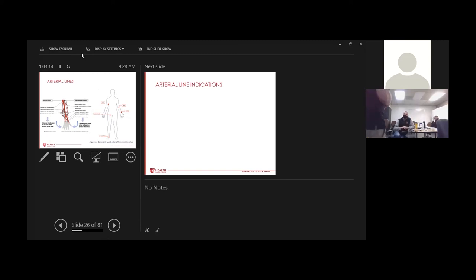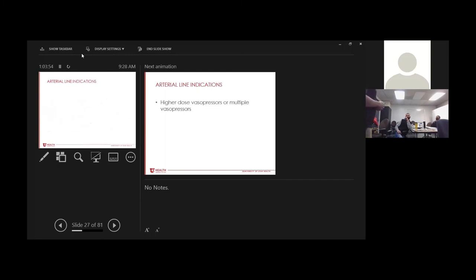So a venous line gives us access for transfusion of product, medications, and invasive hemodynamic monitoring for CVP and such. An arterial line gives you second-to-second data on what their blood pressure is. So an arterial line is a monitor. It's not an intervention, effectively. Central line allows for interventions. We're doing stuff to manipulate the patient's physiology with medications and volume. The arterial line is giving us real-time data to help us decide how effective those interventions are. So they should be going for a venous line first. Yes, if you don't have access to interventions, with an A-line we're not monitoring the impact of anything.